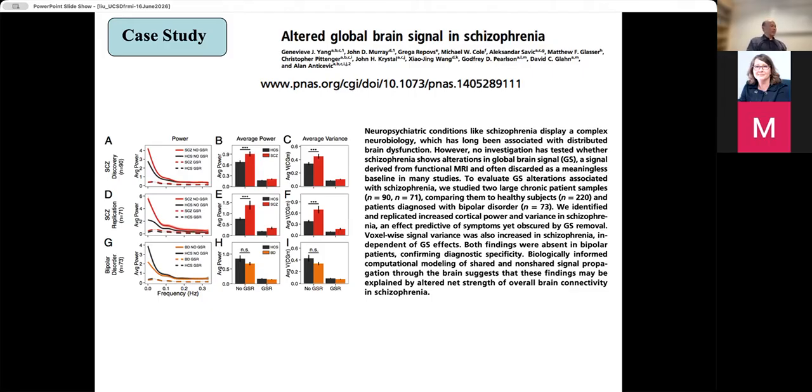Okay, so Tom, the take home perhaps then is, do we need to control for some kind of scale that measures awareness or vigilance or arousal in our fMRI so that we don't mess with global signal? In other words, could that serve as a control for what we're doing with global signal regression?